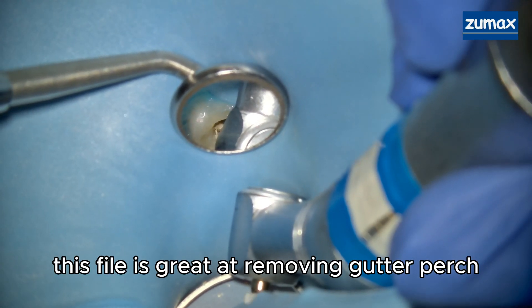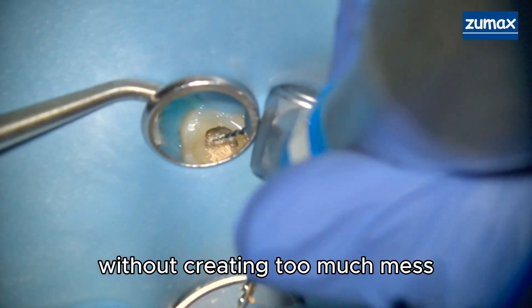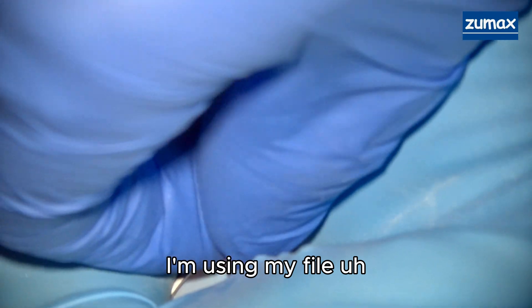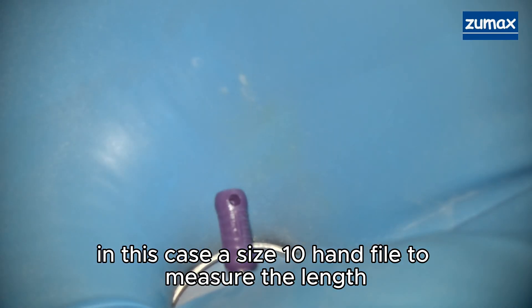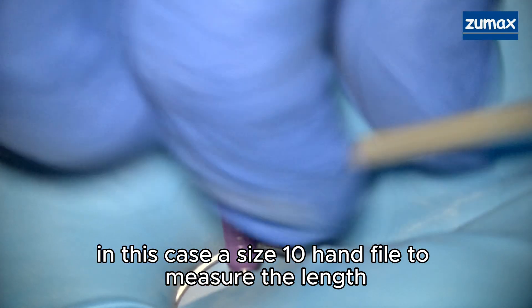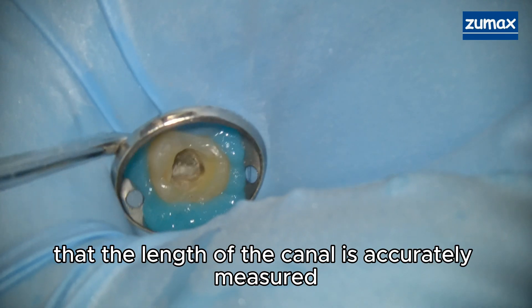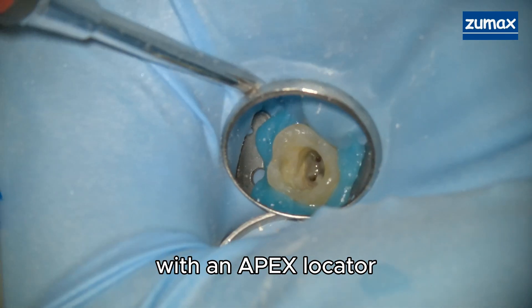I'm first starting off with removing the existing gutta percha. This file is great at removing gutta percha without creating too much mess. I'm using a size 10 hand file to measure the length, as I want to make sure that the length of the canal is accurately measured with an apex locator.